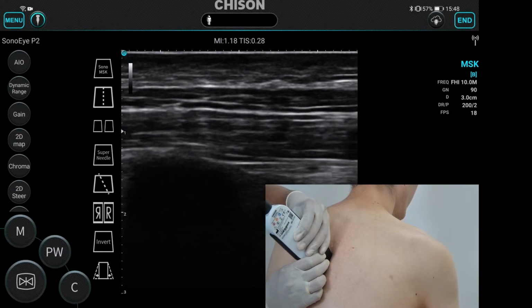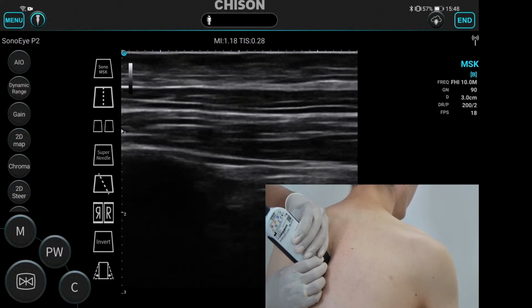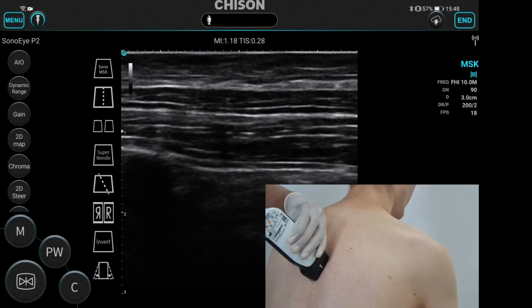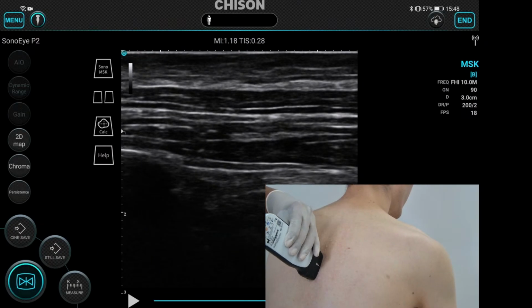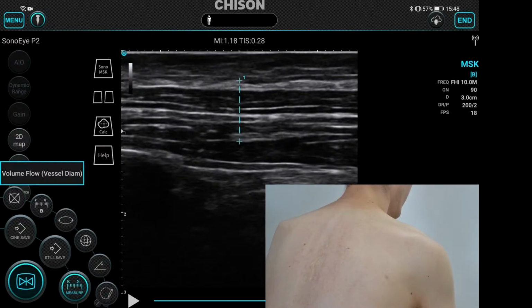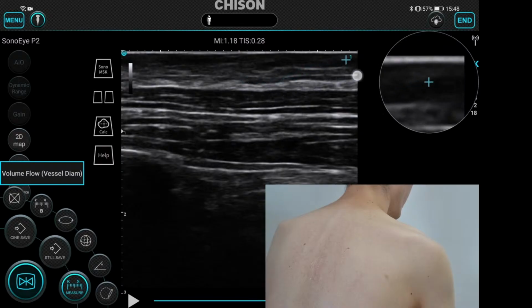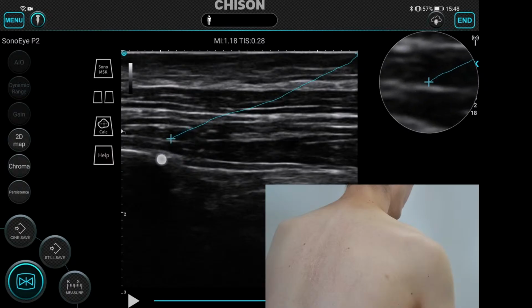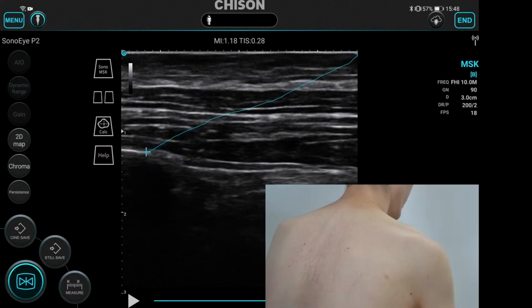So that is the erector spinae muscle, and at this point your needle will enter from either the caudal side or cranial side, and you will be focusing on the transverse process to inject just above the transverse process, so that you can lift the fascia of erector spinae easily.